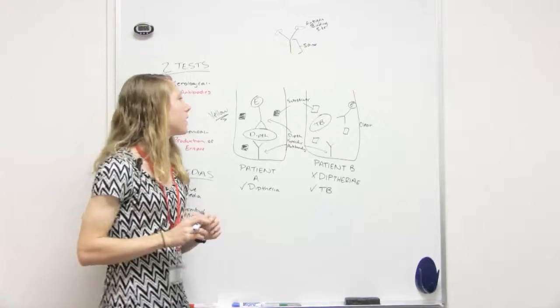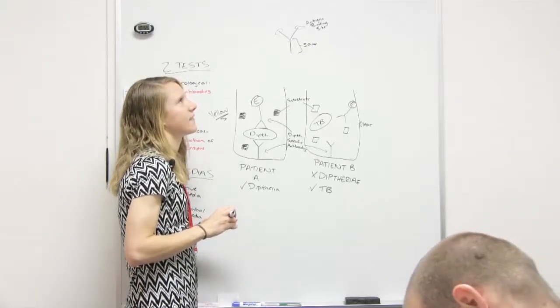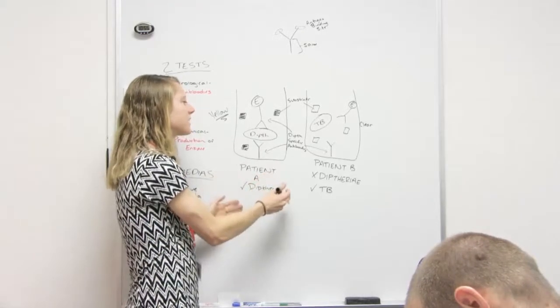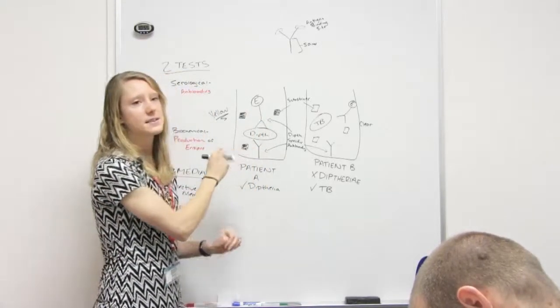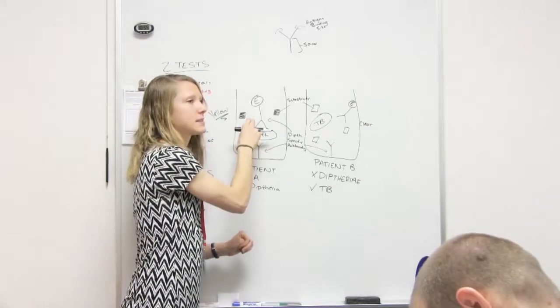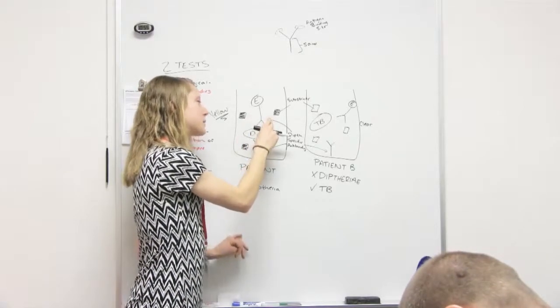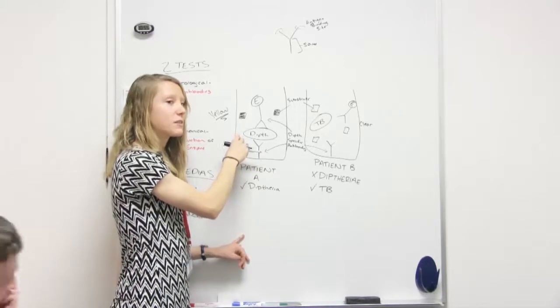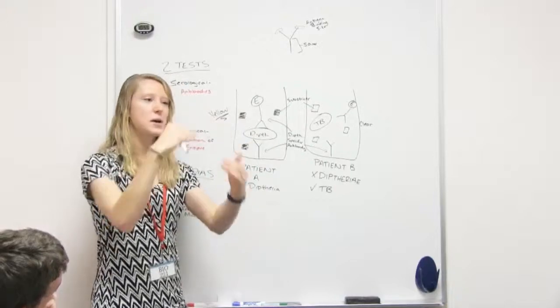Can you say that part one phrase again? The enzyme linked, you worded it really nicely. Okay, let me see if I can remember what I said. When you look into this one, you see it's yellow, right? Because it's yellow, you know the enzyme reacted with the substrate. Now, the enzyme is attached to a diphtheria-specific antibody. So because it turned yellow, you know that the diphtheria-specific antibody with the enzyme attached to diphtheria. And for diphtheria to be in there, you know it attached to the first diphtheria-specific antibody. So I'm just going backwards on the steps.